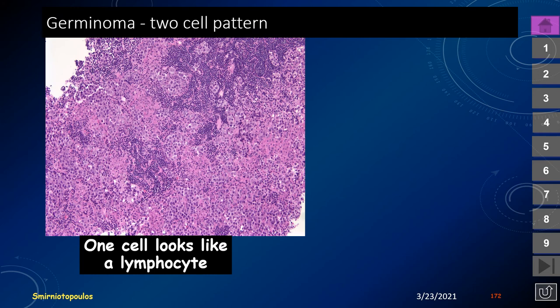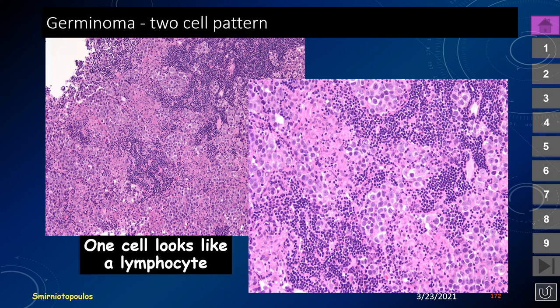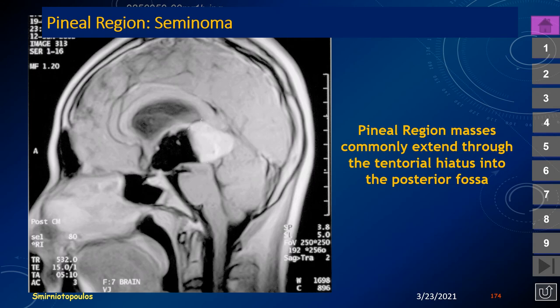The hyperattenuation and restricted diffusion result from the two-cell pattern in germinoma — one of which is a small round blue cell resembling a lymphocyte. Pineal region tumors of almost any histology can extend through the tentorial hiatus into the posterior fossa, either as the growth vector or due to obstructive hydrocephalus from compression of the cerebral aqueduct. About two thirds of pineal region masses are operated on through a suboccipital infratentorial neurosurgical approach.